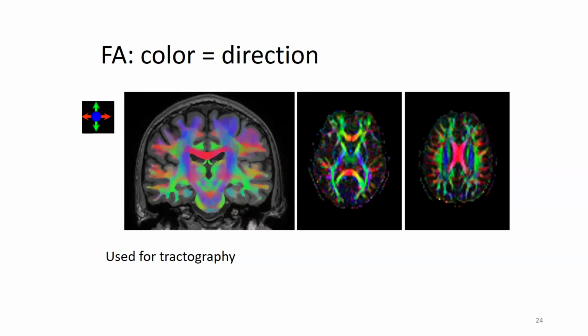So the corpus callosum is a highway with axons and myelin around it, and the water can move on that highway, but I don't know in which direction, because it's just random. It's just random motion of water. It's still Brownian motion, and it's not flow. It's not blood flow. It's not CSF flow. It's not water flow, it's just water motion. So left to right doesn't mean from left to right, but only indicates where the path is.